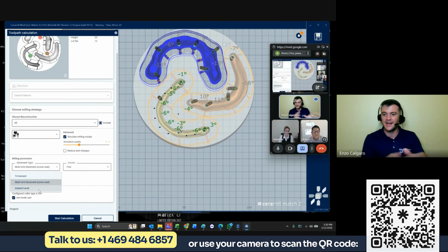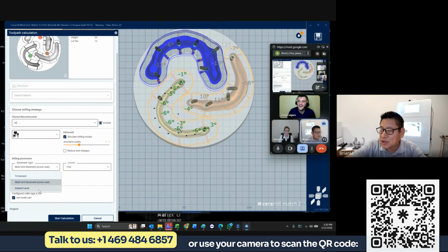I just want to understand the options there. Yeah, so implant level, again, like you said, goes into the implant. So if you guys are a laboratory and you want to follow FDA guidelines, that is technically not legal. You can do it. You can have tinted windows, but you can get a ticket for it, right? You can do it, but legally, that's up to you.